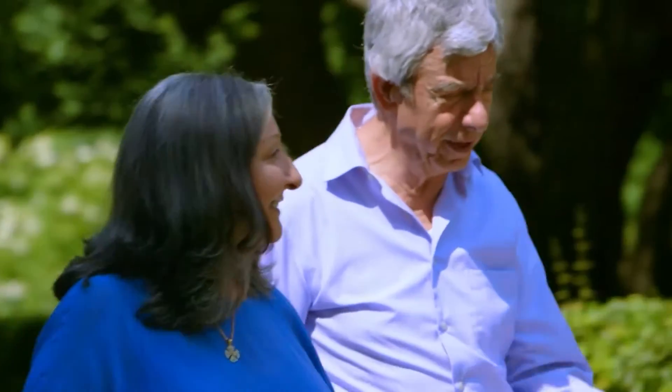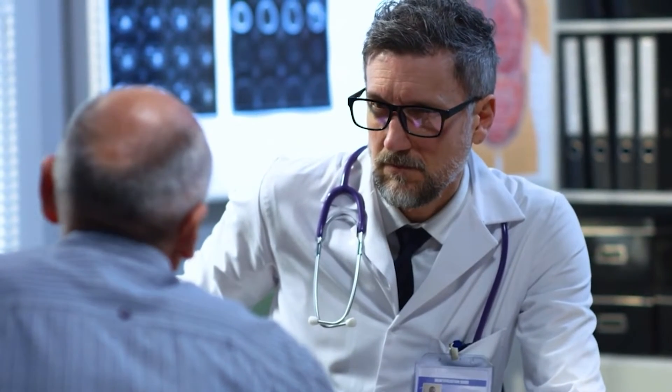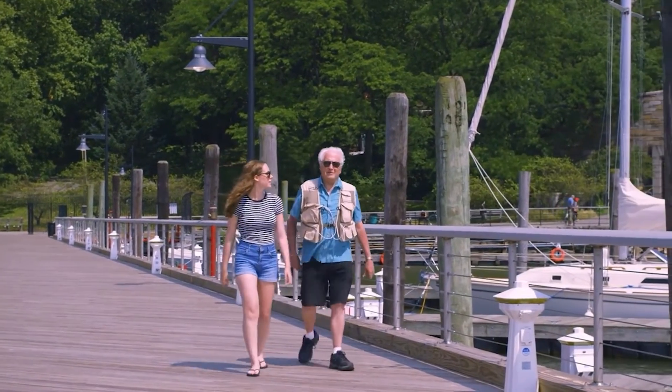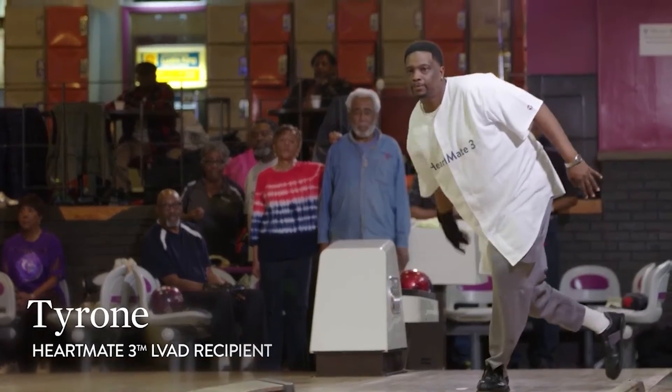You will need to consider lifestyle changes with managing equipment and living with the HeartMate LVAD. If you choose LVAD therapy, your specialized LVAD care team will be with you every step of the way — before, during, and after the surgery. Many LVAD recipients find they have more energy than they did before because more oxygen-rich blood is moving through their bodies.